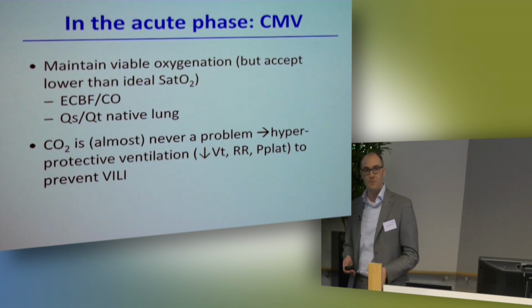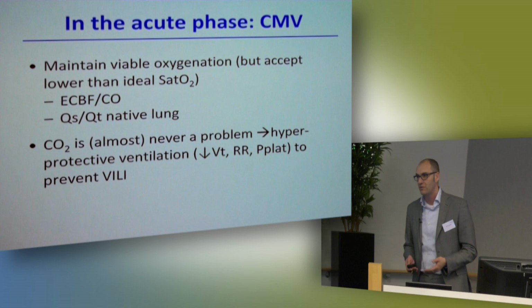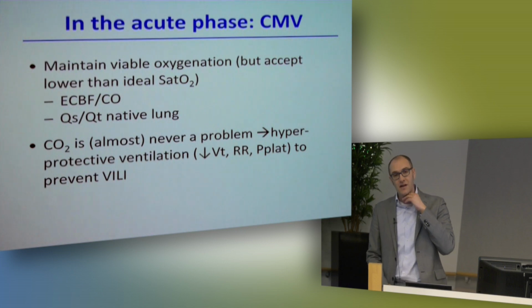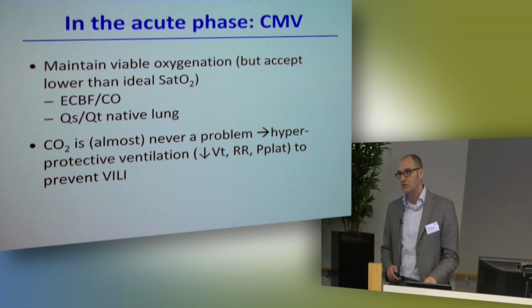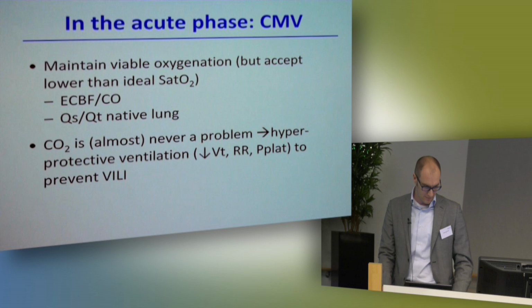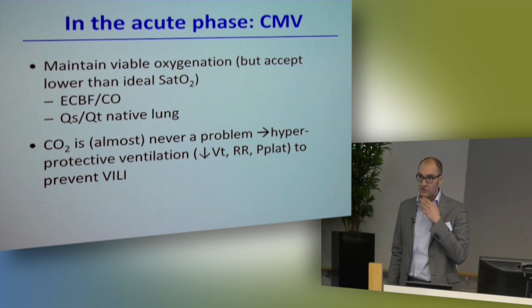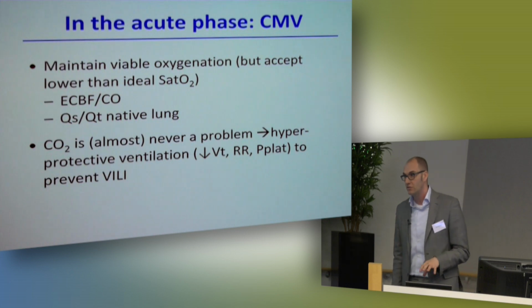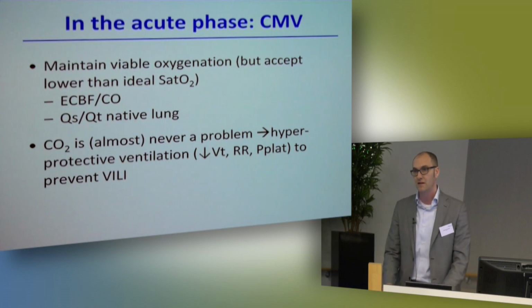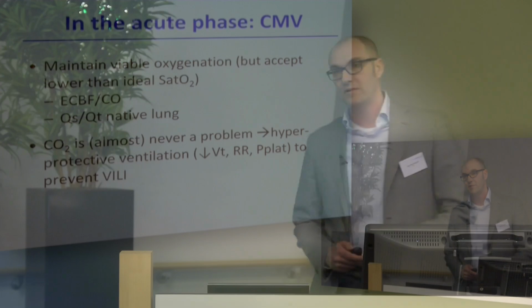So if you have a severely hypoxemic patient, you put him on ECMO, you want to oxygenate him, you need high blood flow, which means big cannulas and a lot of technical problems. While VV ECMO is much more efficient for CO2 removal. This is due to the different ways of transport of oxygen and CO2 in the blood, because you know that in one liter of arterial blood, there is almost twice the entire metabolic production of CO2. So technically, you could remove all the CO2 produced by the body with less than 1 liter per minute of extracorporeal blood flow. And this is the basis for the low-flow CO2 removal devices that Christian will talk about later.